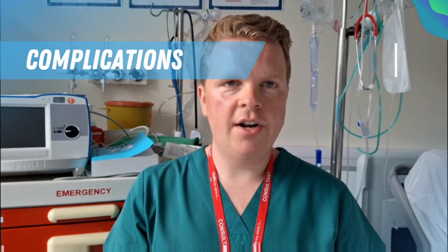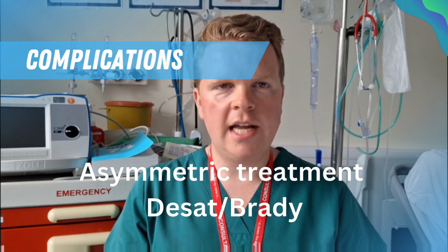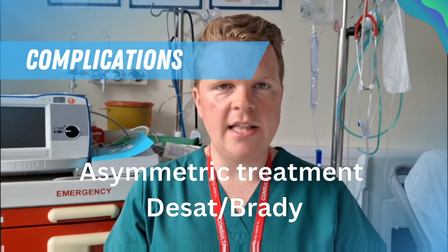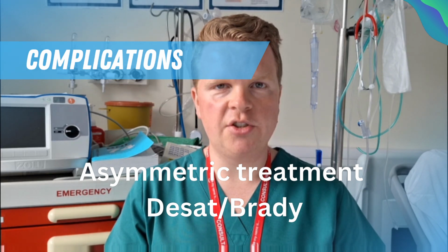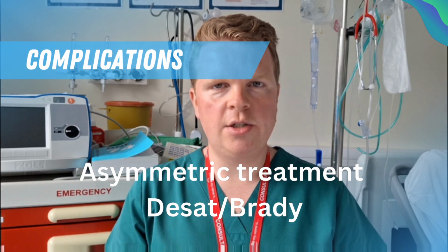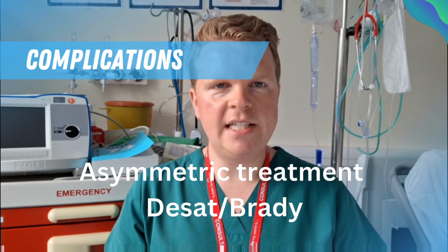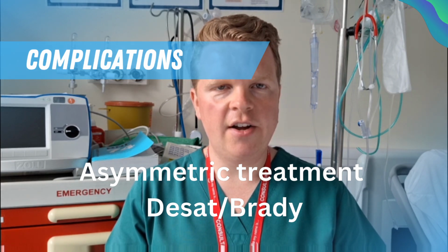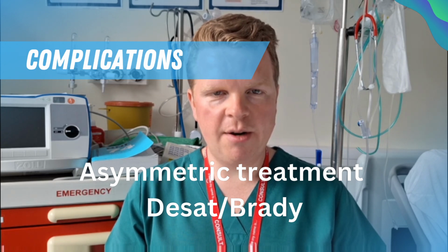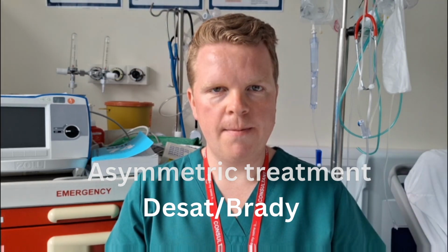If the LISA catheter is passed too far through the cords into the right main bronchus, there will be a very asymmetrical improvement in the degree of RDS seen on the chest X-ray. There can also be desaturations and bradycardia associated with the procedure, but this is more commonly due to vagal activity rather than decompensation as in intubation, and the risk of this can be reduced through the use of atropine.